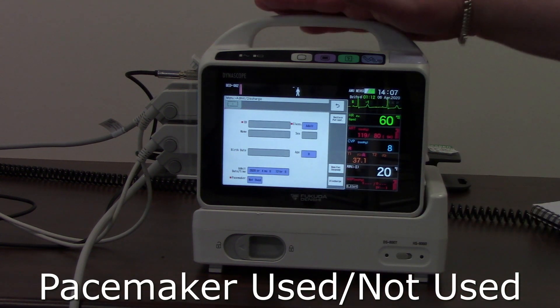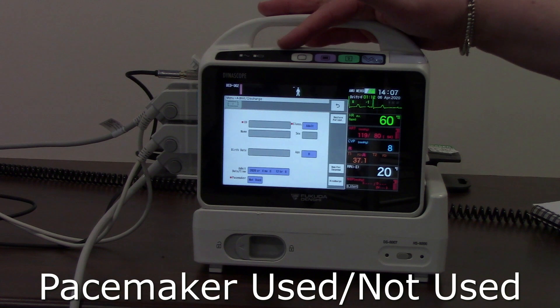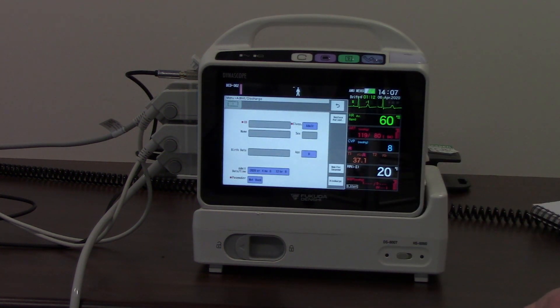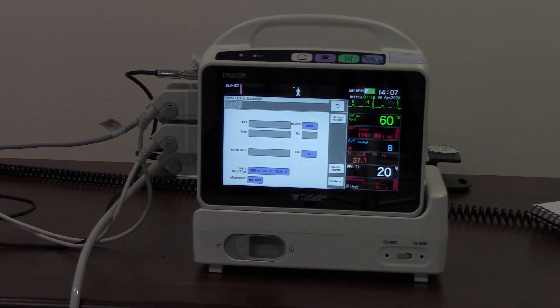If you've undocked the 8007 from a bedside monitor and you've already input this information, the information will already be here. When you undock, you'll see the patient name at the top of the monitor and this window will be populated already.